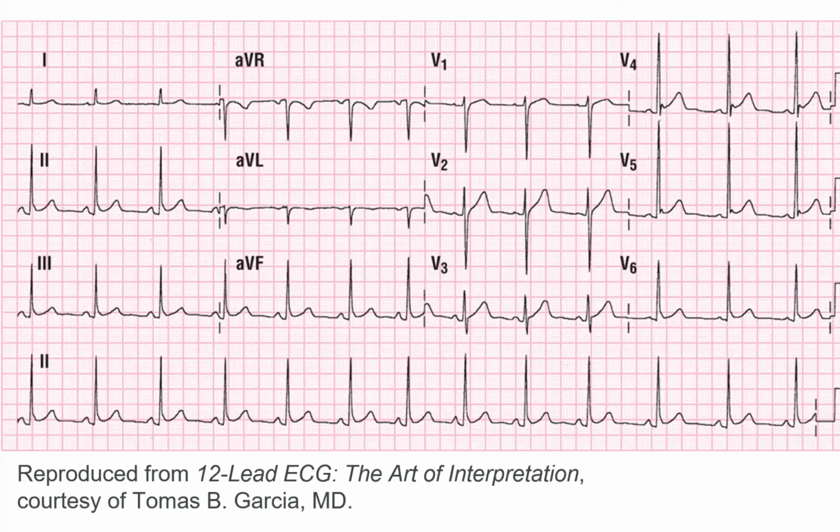So we're here. Hopefully my camera doesn't get lost. All right, so we decided V1 is all right. We do not have a bundle branch. So we look at 1 and aVL at the same time. Looking at 1 first. Elevation, neutral, depression? Neutral. aVL. Neutral. 2.